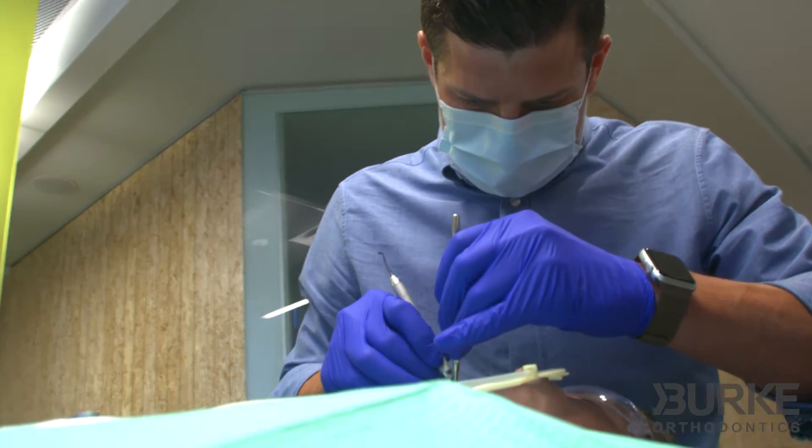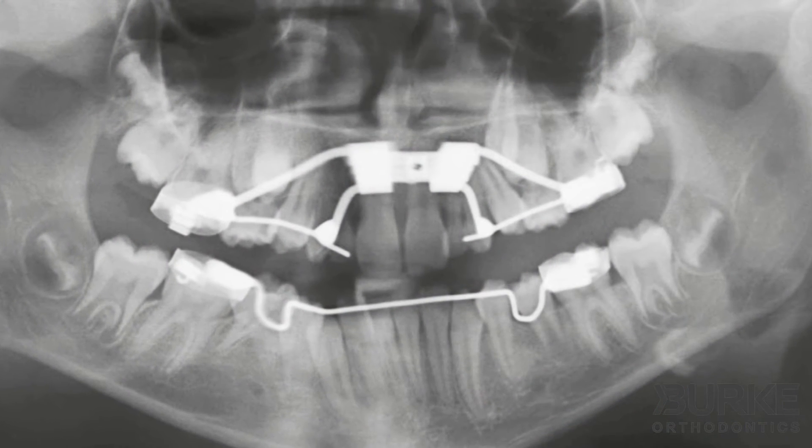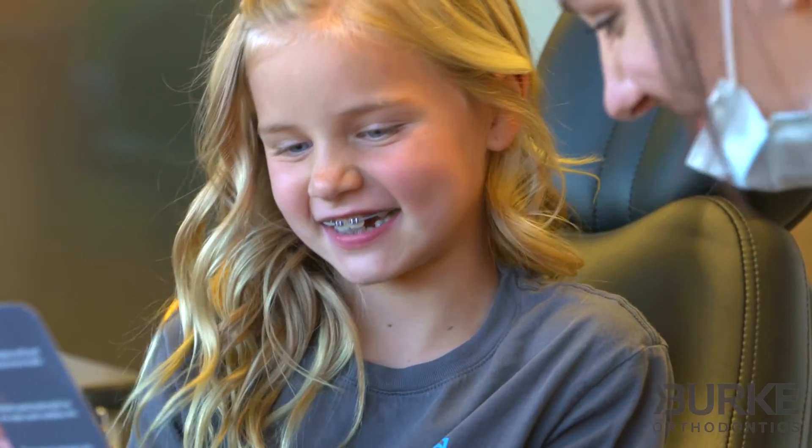Successful palatal expansion requires that the growth plate located in the roof of the mouth not be fused. Fusion of this growth plate occurs at skeletal maturity around age 15, making it very important to consult with us about the possible need for your child to be treated with a palatal expander.